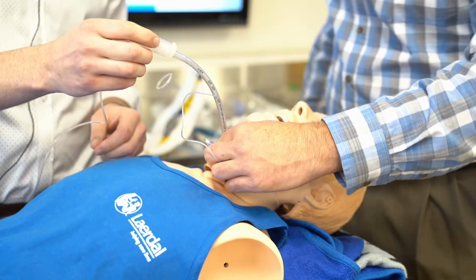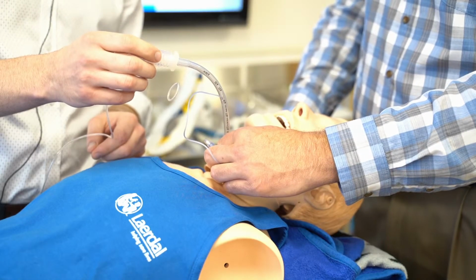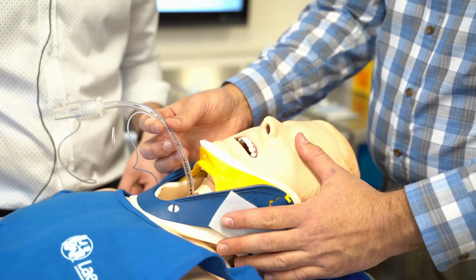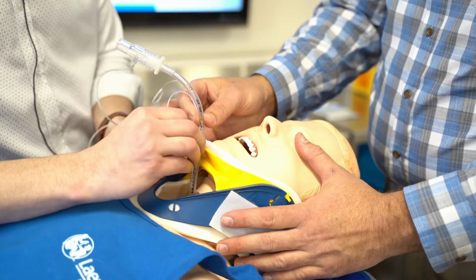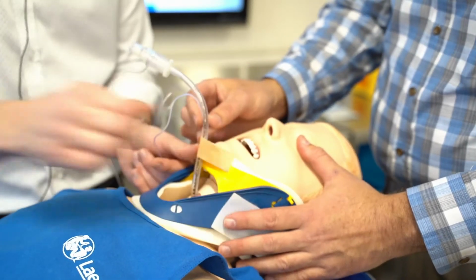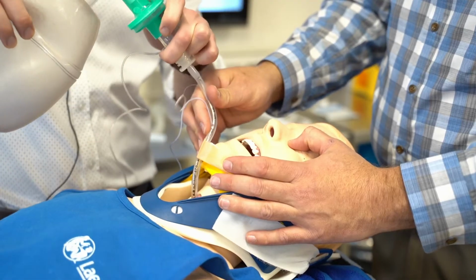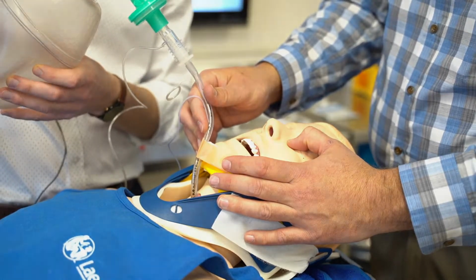Perfect. We have good waveform. Now we're going to go ahead and secure the tube and apply our C-collar. Following securing the tube and putting our C-collar on, we're going to go ahead and further secure it to the C-collar and then ventilate with our BVM. Now we're going to rapidly transport to the closest receiving facility.